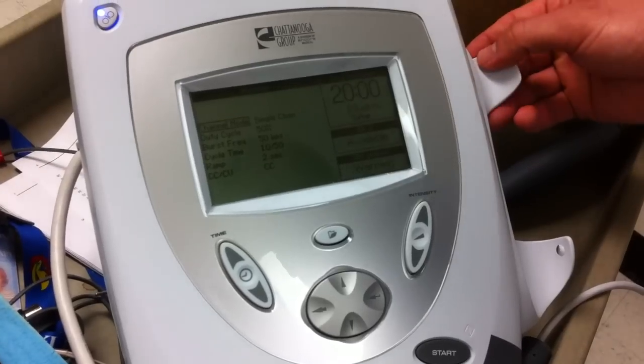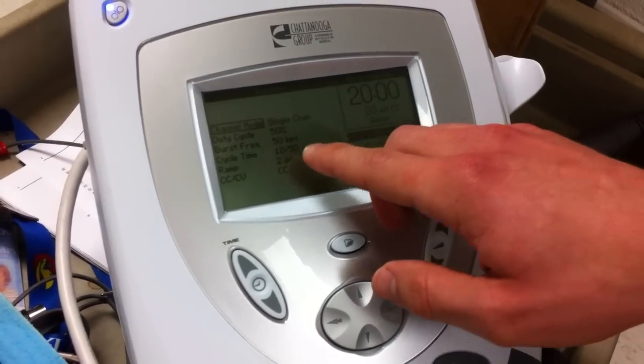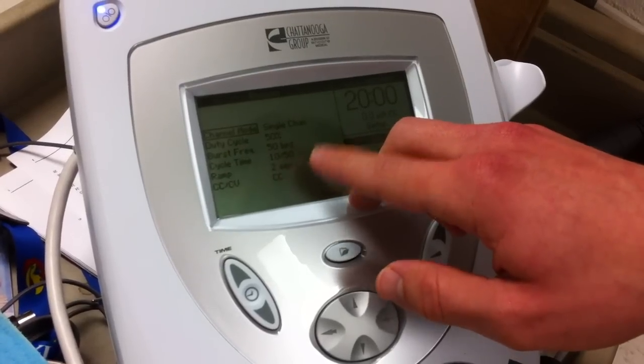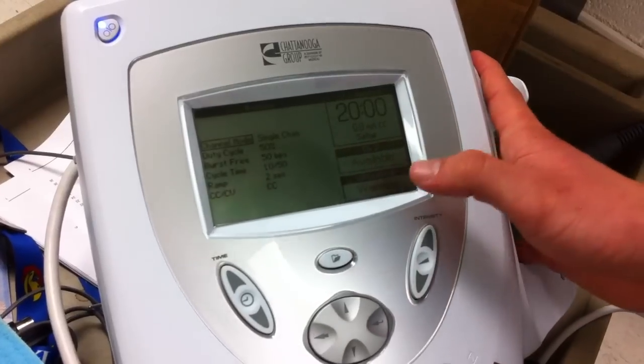That's for a more natural type of muscle contraction and for patient comfort. We set a burst frequency of 50 bursts per second with a cycle time of 10 seconds on and 50 seconds off.